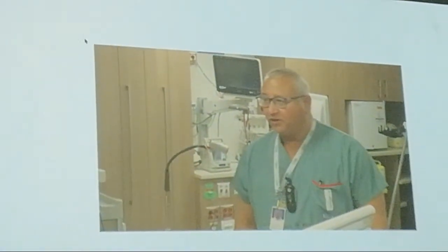Okay, everybody, let me just pause the video. When you apply the oxygen reduction test, you have to organize a table and record each step you do. You should not just apply it and keep the numbers in your mind. The person usually doing that is John or one of his colleagues, a respiratory therapist, but a physician or anyone can do it. If you don't have near-infrared spectroscopy, then record the pulse oximetry number and the oxygen saturation at the same time.